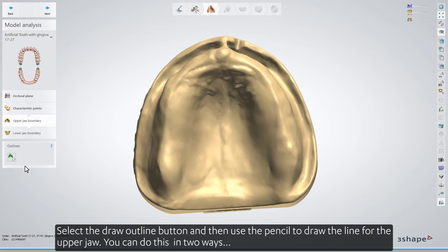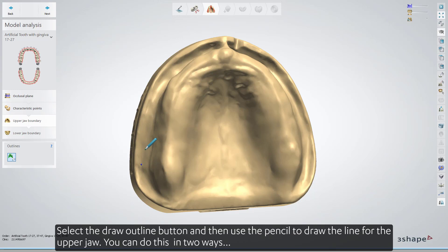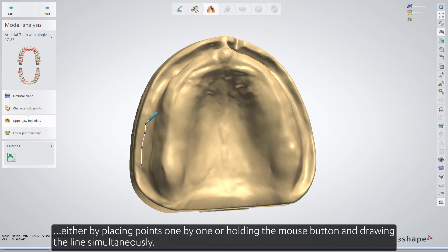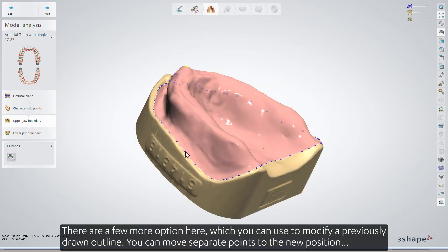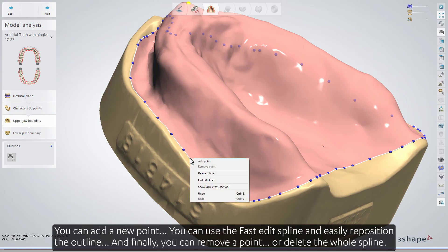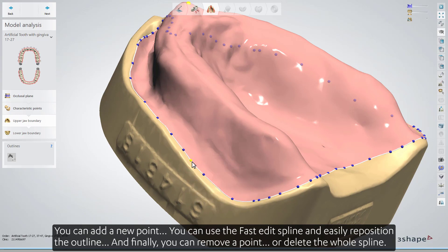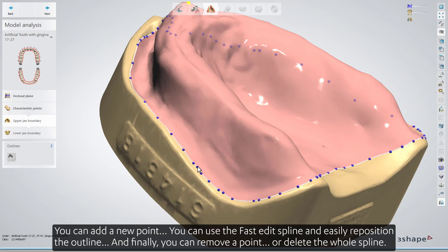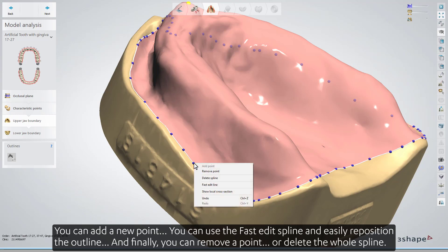Select the Draw Outline button, and then use the pencil to draw the line for the upper jaw. You can do this in two ways: either by placing points one by one, or holding the mouse button and drawing the line simultaneously. There are a few more options to modify a previously drawn outline. You can move separate points to a new position, add a new point, use the fast-edit spline to easily reposition the outline, and finally, remove a point or delete the whole spline.